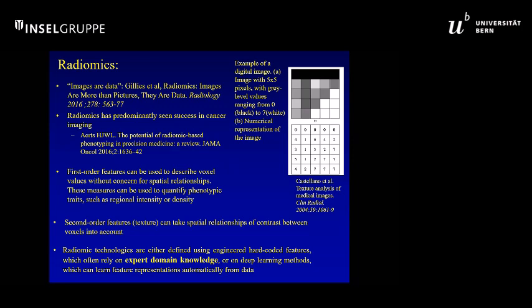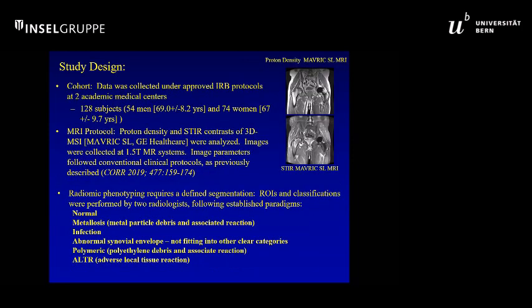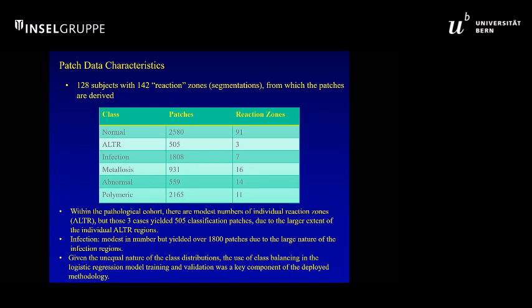So this particular study was done using expert domain knowledge. We used our characteristic protocol, and then with myself and one other radiologist, classified these phenotyping into all these different tissue reactions. So these create these so-called patches. So in an aggressive synovial, host-mediated synovial response like infection or an adverse tissue reaction, it creates a lot more of the patches, whereas even though the prevalence of things like infection was much lower, it creates a large number of pixel patches, if you will.